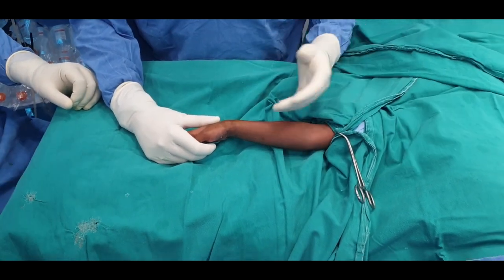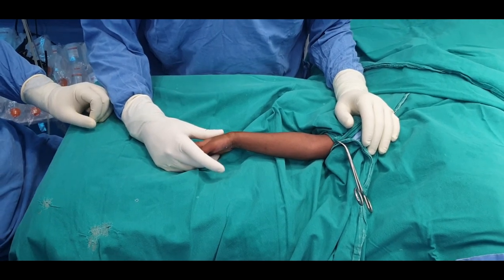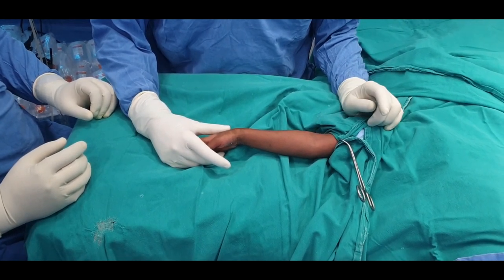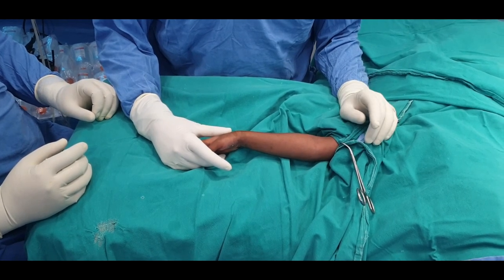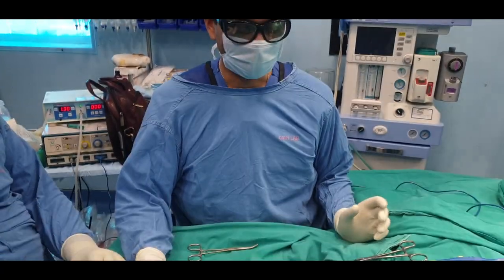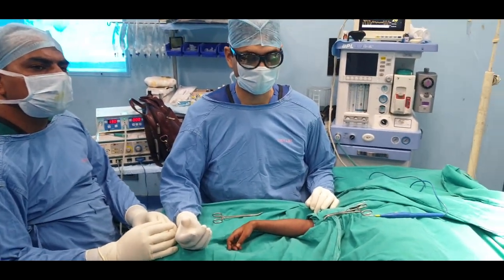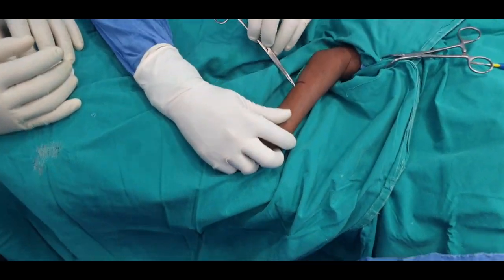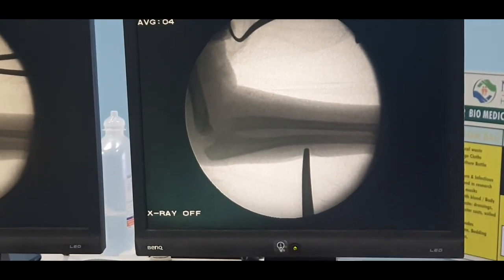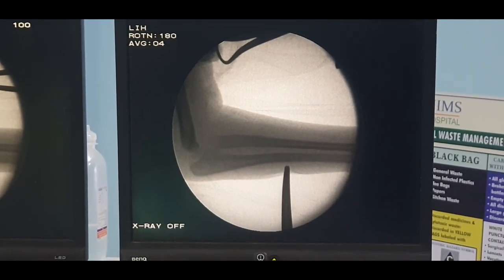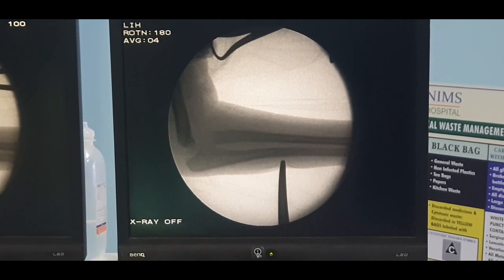Now we are ready. We have draped the patient. The patient is supine. We have put a small tourniquet. Now I am going to use the C-arm to identify the apex of the plastic deformation of the ulna. The apex will be the site of my osteotomy so that we can get the ulna straight and gain the length. We tried to reduce this closed but as expected, it has not fallen back in place — the radial head is dislocated. I have now marked my skin incision at the apex, checking the apex of the plastic deformation on the C-arm so that I know where my osteotomy will be.